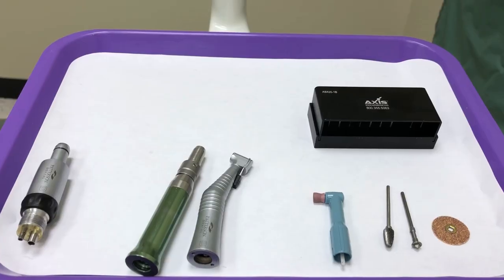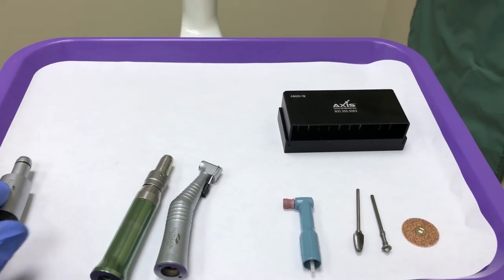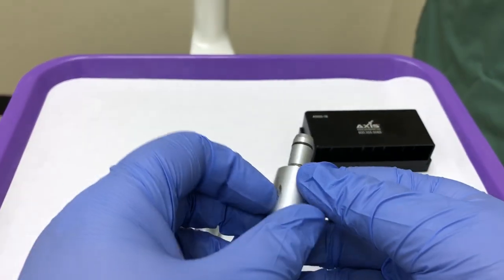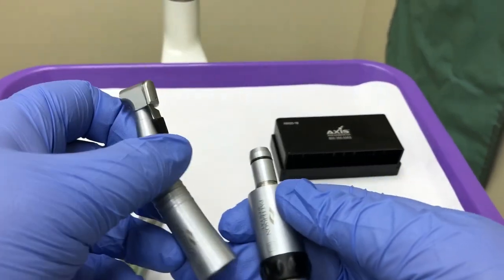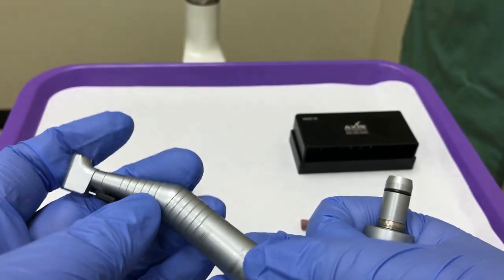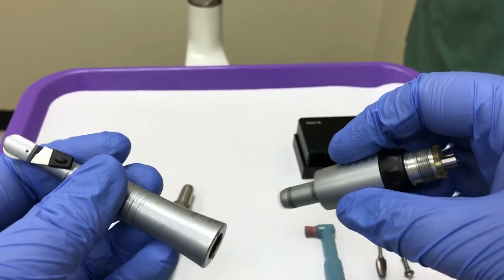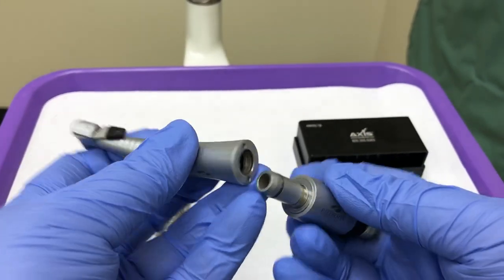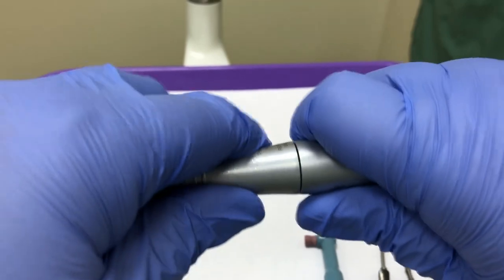There are several different ways to assemble your low-speed handpieces. For the first example, we're going to attach our contra angle. This is a quick connect adapter. You simply push the two pieces together and it will click into place.